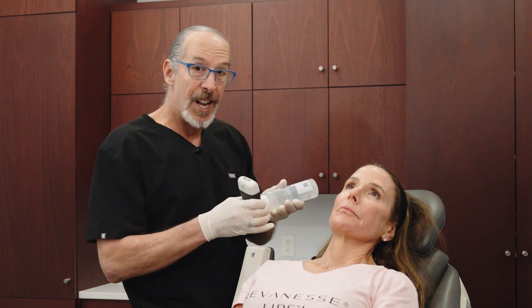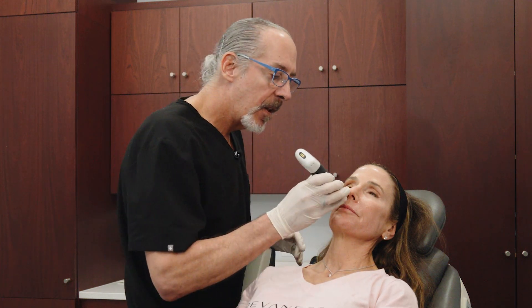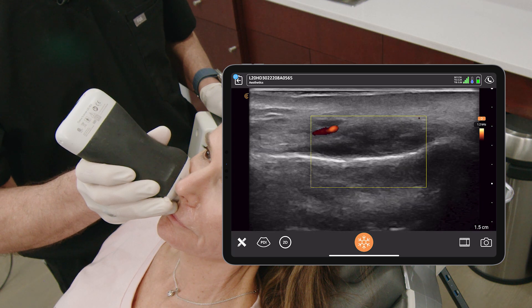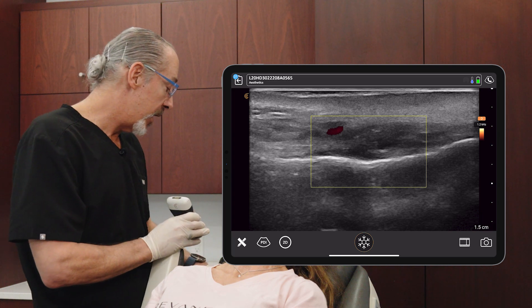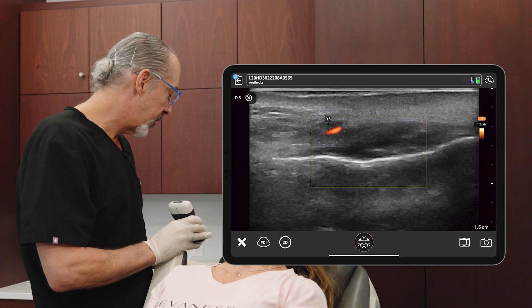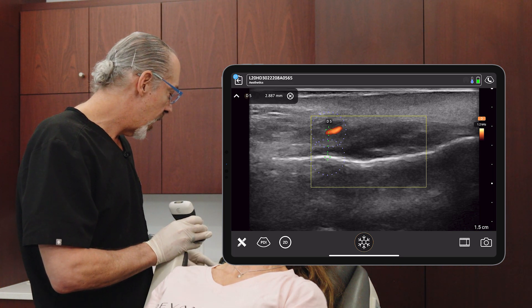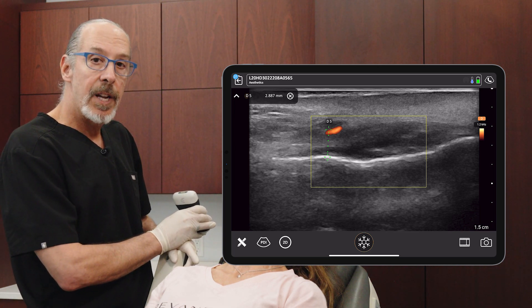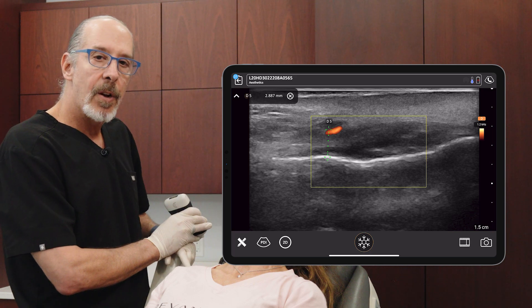I'll get a little more gel. On this side, you can see the artery — it's a little bit closer to the bone. Let's see how deep this artery is from the bone. We check the distance here, and this distance is 2.8 millimeters. So this is also safe to inject down under the bone. But make sure you are on the bone when you're injecting.